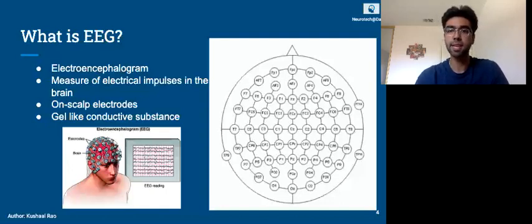We compare the baseline activity of someone just sitting there to the ERP, the event-related potential, to see what is going on inside the brain when a particular stimulus is presented or a task is performed. So it's all relative. We subtract what the stimulus generated from the baseline to get an idea of what is going on.